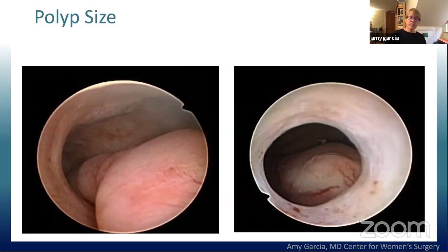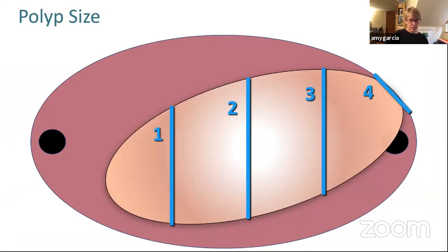So then we have this dilemma of what will we then do to remove pathology? The most cost-effective way is to get very, very good with your scissors. And this will take, of course, more time than some of our automated devices. However, it can be done. One of the first ways to do this is to literally segment entirely the polyp. So you fully transect through the polyp. If you don't have to remove pieces one at a time, that's really great.